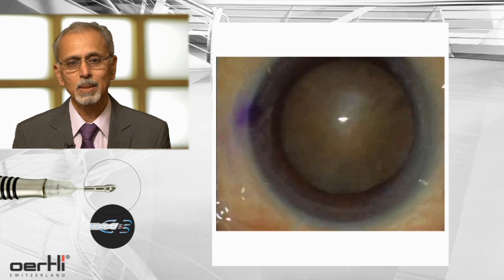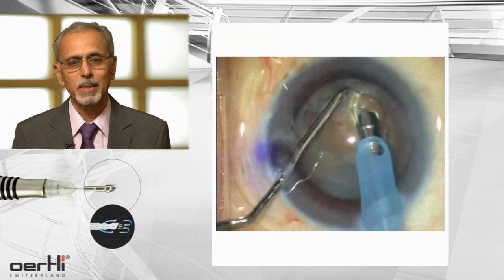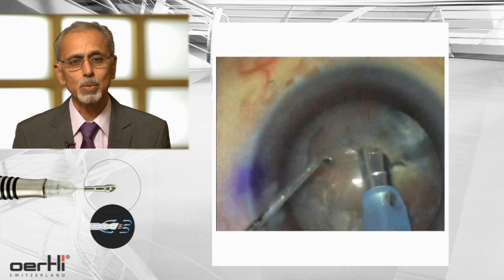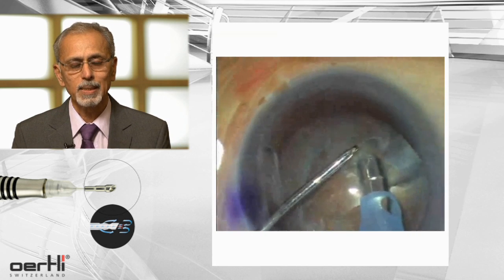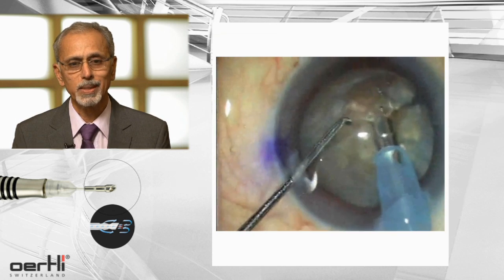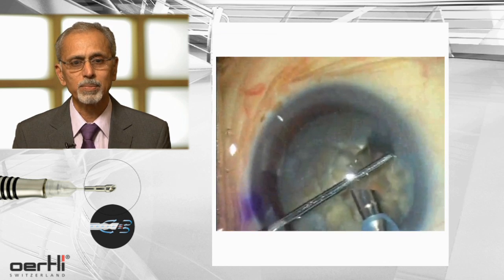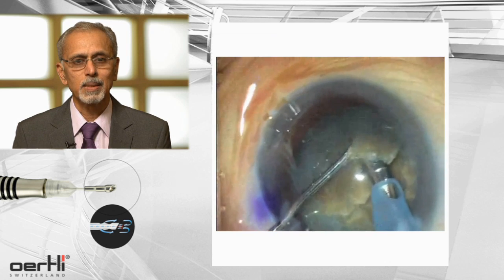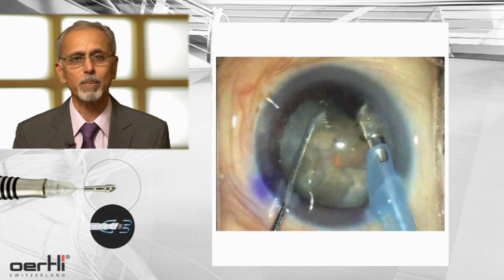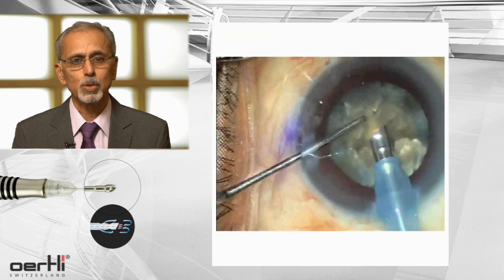Let's look at this case — this is one of those hard cataracts. After viscoelastic is injected, a rexis is performed. This is the EZ-Tip 2.8. To tackle or disassemble these nuclei, you should get an excellent purchase on the nucleus. You keep your FACO-Tip in the center, get a good hold on the nucleus, and use your sharp tip chopper. What you see here is a vertical chop. The fragments are held firmly with your FACO-Tip and with the chopper they are split into smaller and smaller pieces, and once you have converted them into small pieces, you start emulsifying them.